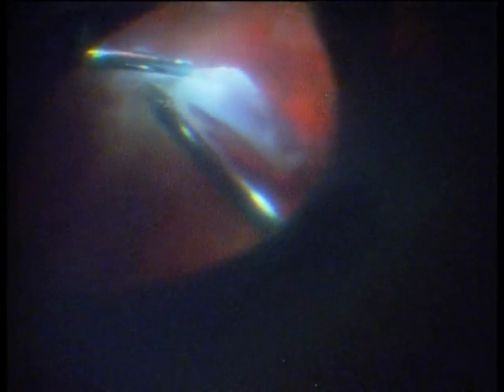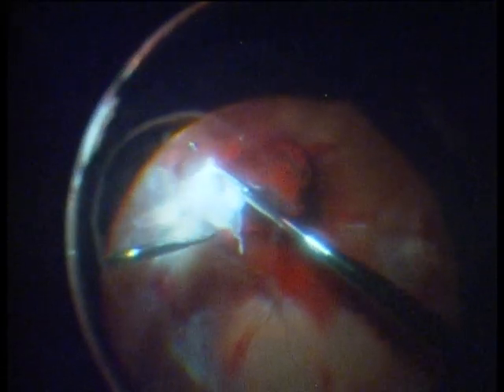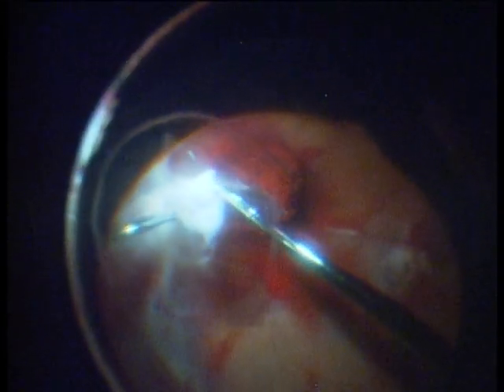One should definitely try to avoid inducing retinal ruptures. These membranes can be slowly and with a lot of patience be removed with the Knopf spatula, with the straight vitreous scissors, and retractor.